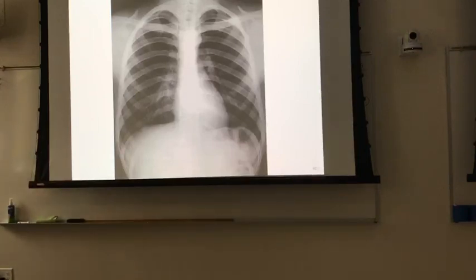And it gets a little bit difficult to count your vertebra, which should correspond to your ribs. But your first two ribs are really stacked on top of each other, the posterior ribs. We can determine posterior versus anterior ribs, but the posterior ribs come all the way to the spine. They actually touch the spine. Anterior ribs don't touch the sternum. What you've got right out in here is costal cartilage that in turn connects to the sternum. So we've got first rib, second rib, third rib, fourth rib, and we've got clavicle. This is a clavicle, and it comes in right there.